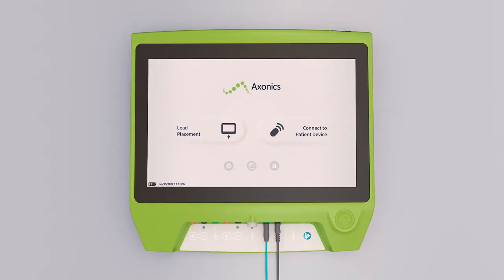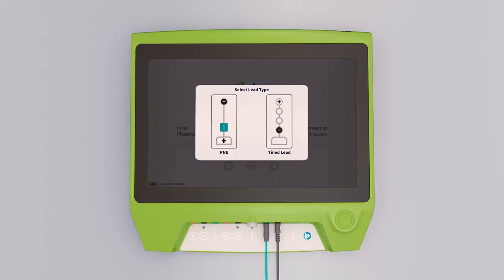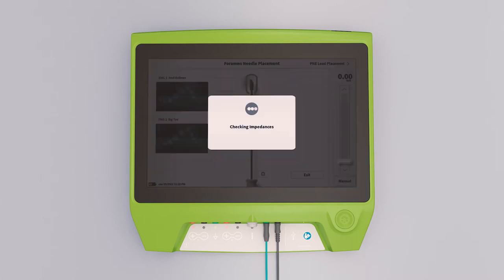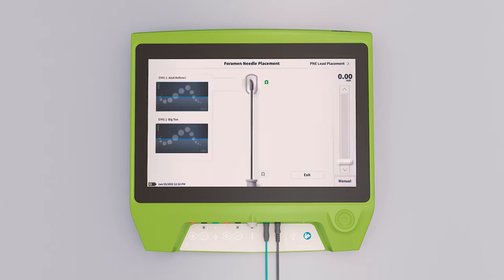The clinician programmer is used to provide stimulation to test for patients' responses. A typical S3 sensory response is a tapping, tingling, or vibration in the genital, perineal, or rectal area. If tolerated by the patient, amplitude can be increased until a motor response is observed.